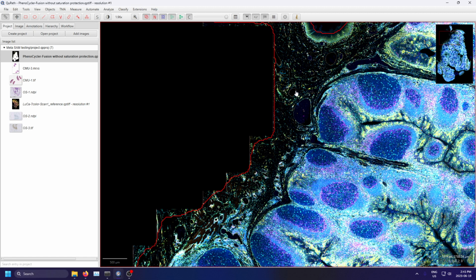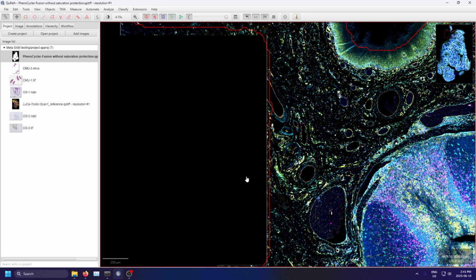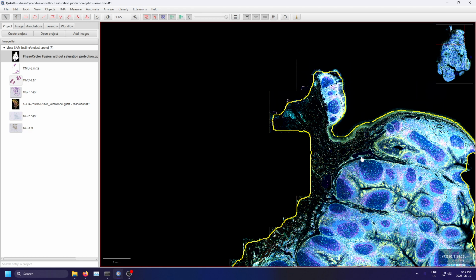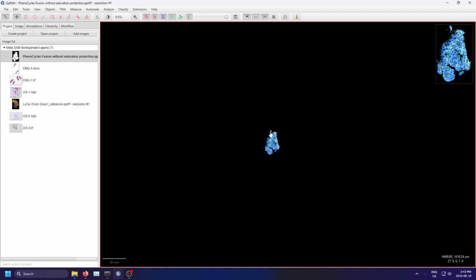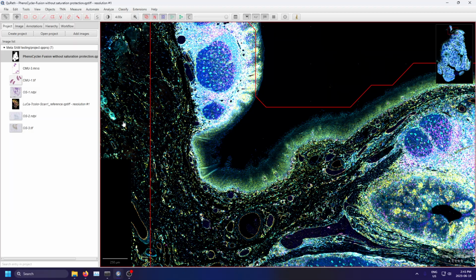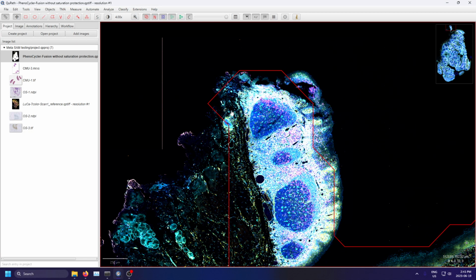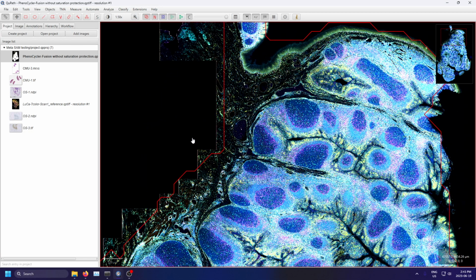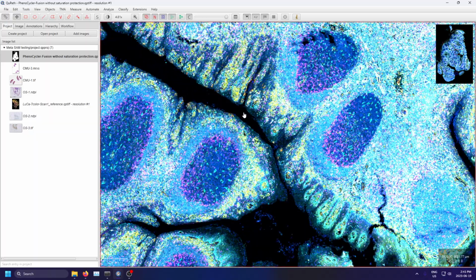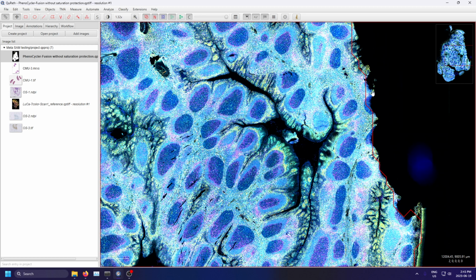So you can see that the outlines are somewhat smooth, somewhat continuous, but if I were to try this again at a much lower downsample factor, now the lines are a little bit more jagged, for lack of a better term, or coarse, I guess you could say. It really depends on the scale at which, within the viewer, you currently have zoomed in.